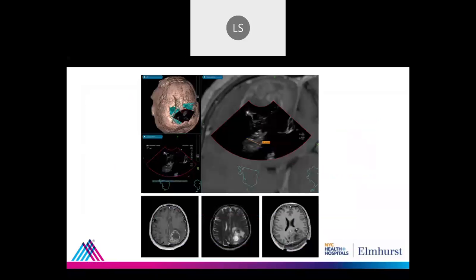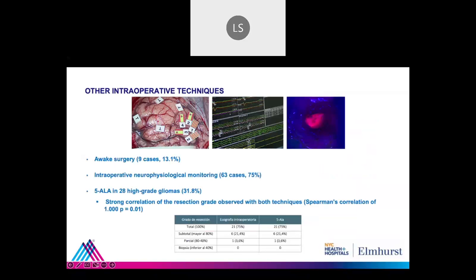This is a case where we thought that we had resected everything, and then we found this residual tumor with the ultrasound, and this is how it looks on the MRI. This small area here. And then we also use other techniques that we usually use, like awake surgery, intraoperative monitoring, and 5-ALA. This is in Spanish and Catalan as well, because we were asking the patient to speak in Spanish and in Catalan, right?